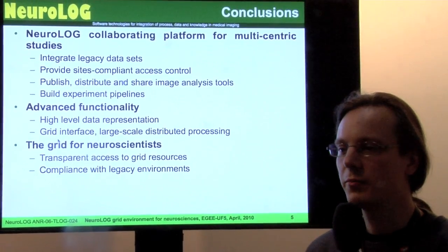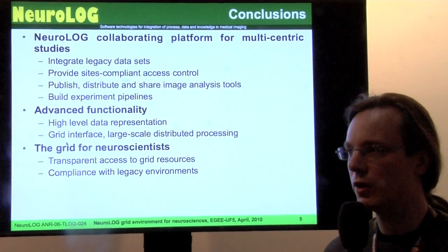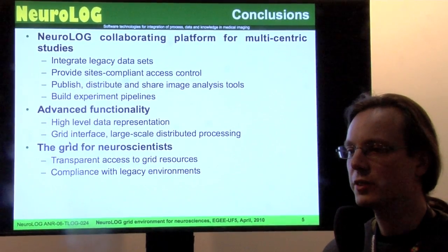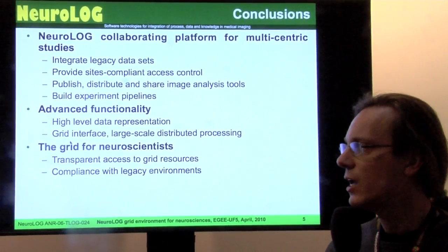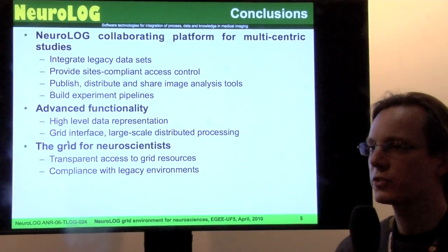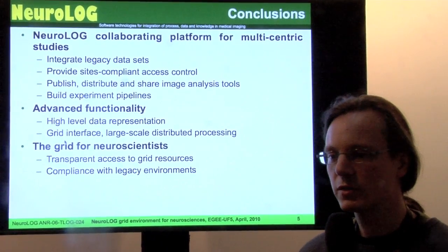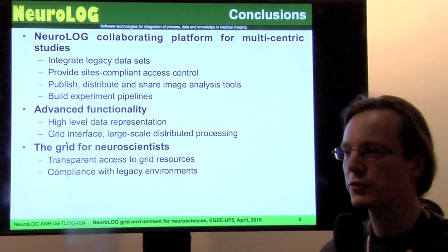So the NeuroLog environment is facilitating the access to grid infrastructure to neuroscientists, providing an environment to integrate existing legacy neuroscience resources, and providing advanced functionality for browsing the neuroimages, performing complex computations, and obtaining meaningful results for the scientists.